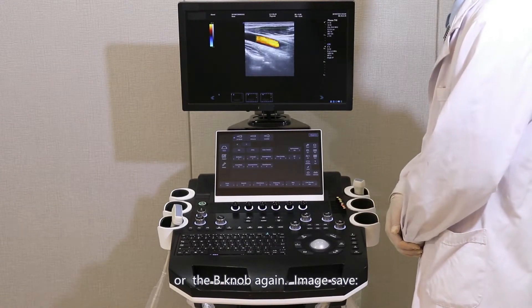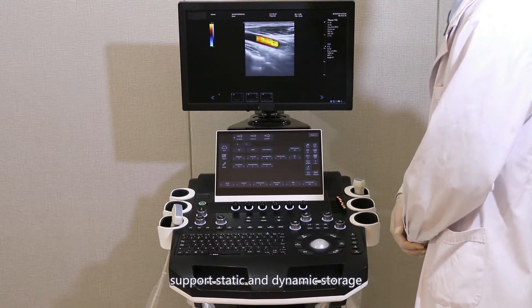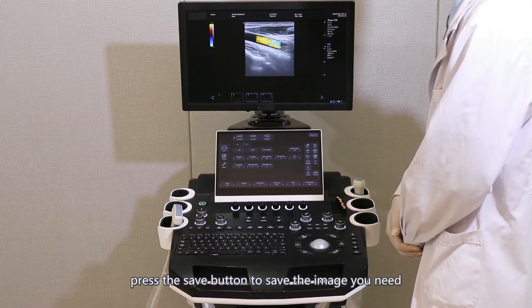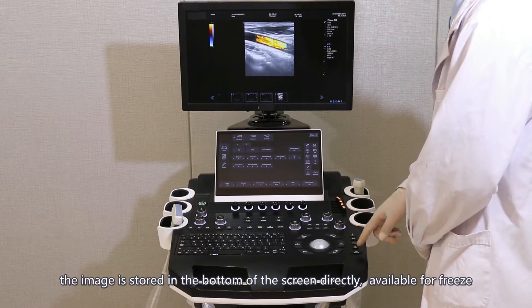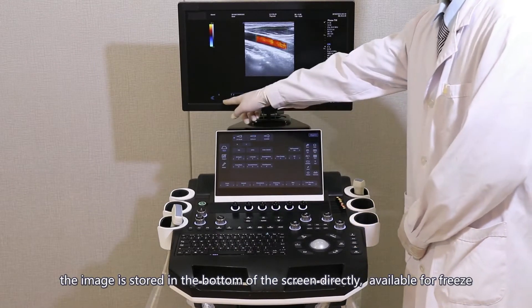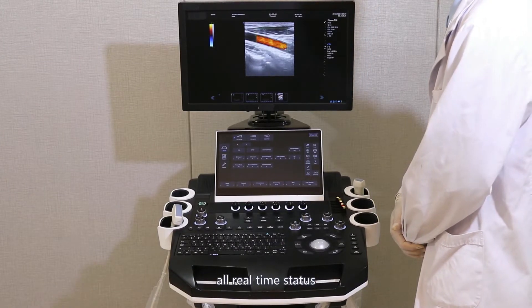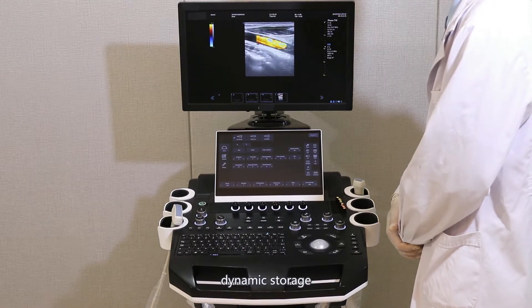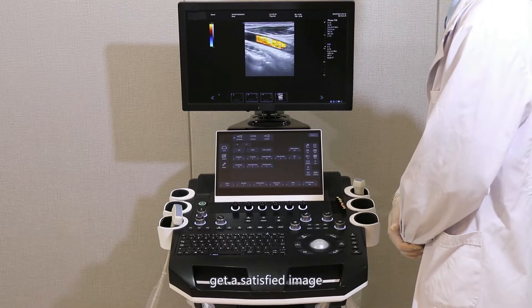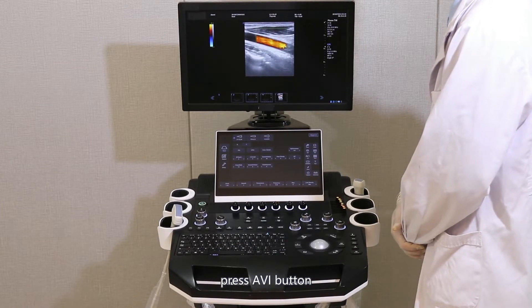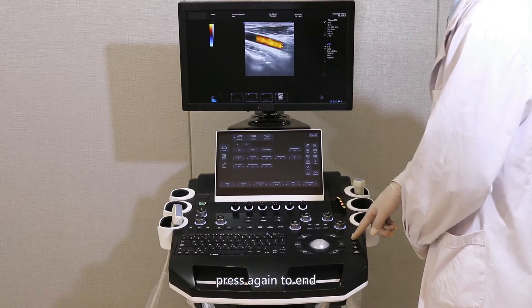Image save: the device supports static and dynamic storage. Static storage: press the Save button to save the image you need; the image is stored at the bottom of the screen directly, available for freeze or real-time status. Dynamic storage: get a satisfactory image, press the AVI button to begin saving the video, and press again to end.